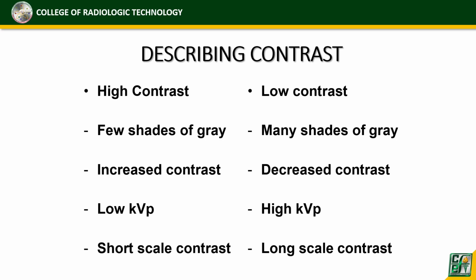On the other hand, we have low contrast. Syempre, kabaliktaran siya ng high contrast. So, there are many shades of gray, 50 or more, depende.